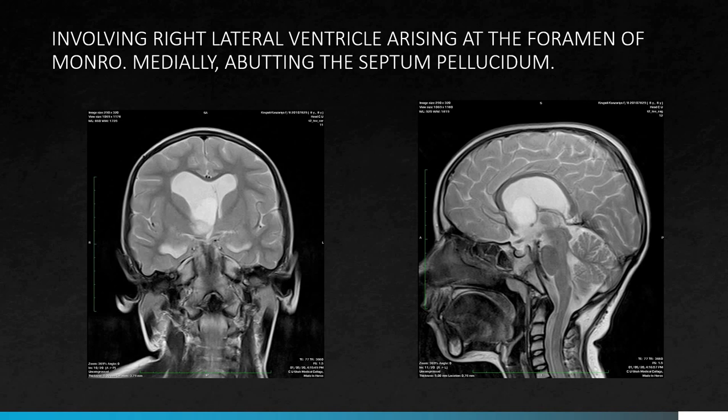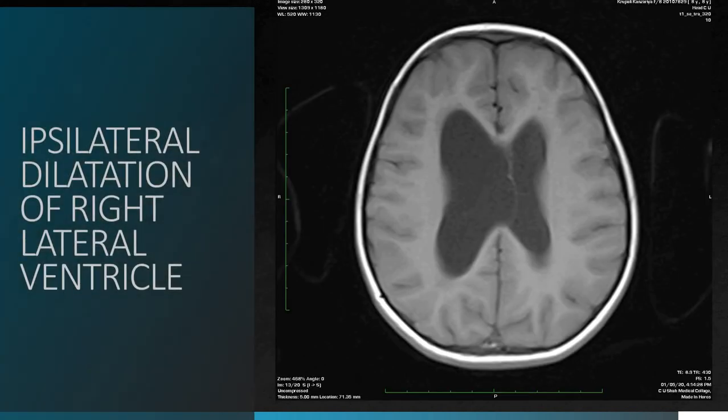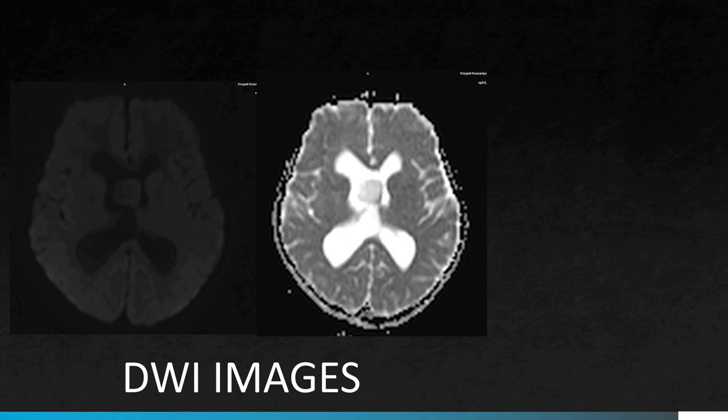Medially, the lesion is abutting the septum pellucidum and the lesion is causing mild obstructive hydrocephalus. There is ipsilateral dilatation of the right lateral ventricle, which is suggestive of the intraventricular location of the lesion.